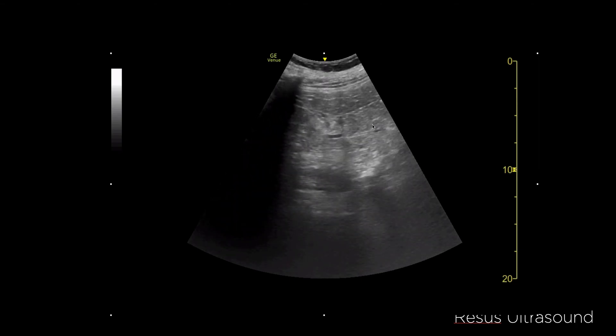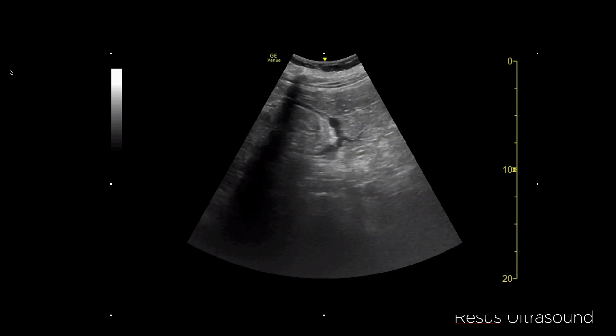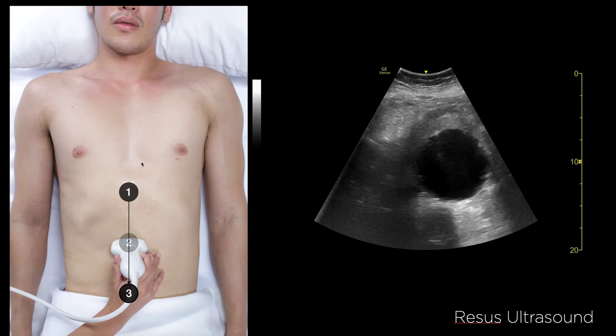So to recap: FAST positive and an unclear psoas muscle both indicate something is wrong. Remember: one, two, three scanning points, and measure outer-to-outer wall diameter — more than three centimeters confirms Triple-A. Thank you everyone and happy scanning!